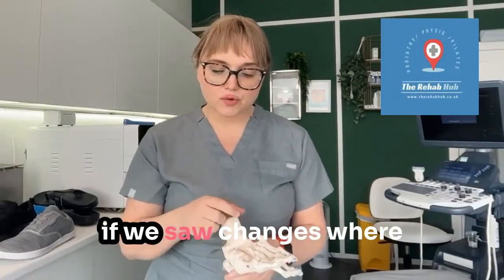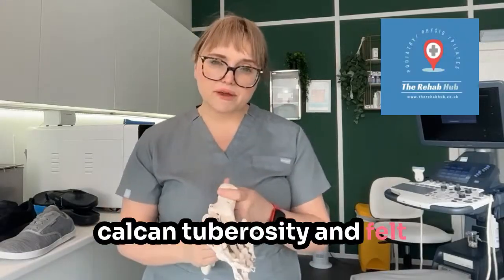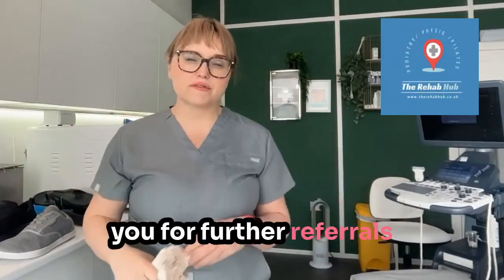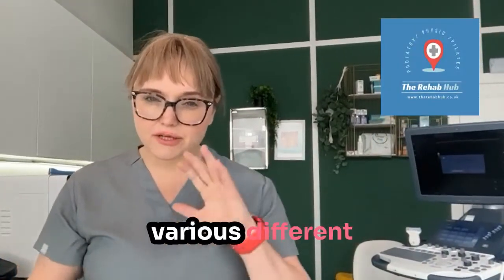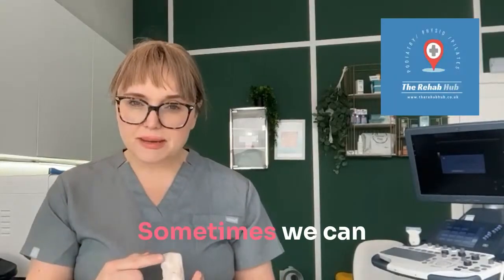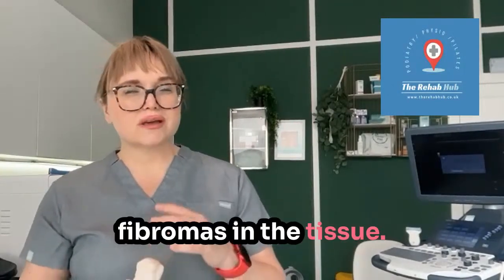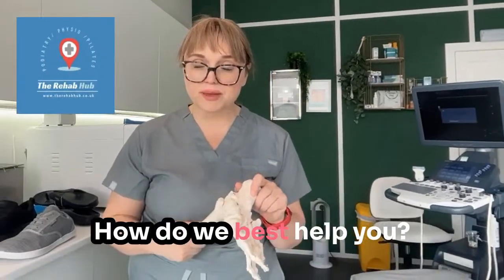If we saw changes where the fascia attaches to the calcaneal tuberosity and if there was inflammation, more of an enthesitis, that can link into a bigger clinical picture where we might need to send you for further referrals and possibly on to things like rheumatology. So we can pick up various different conditions by looking and seeing, but it depends what we're seeing. Sometimes we can see tears in the tissue, sometimes we can see thickening of the tissue, sometimes we can see fibromas in the tissue. That then helps us build a picture of what we do with you. How do we best help you?